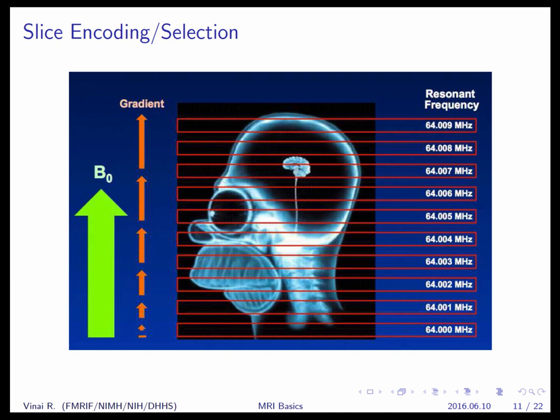So the question, I'm just going to say this for the recording, was how can we tell between the different tissues, or how to localize within the tissue? The answer to that is the differences that the hydrogen atoms experience because of the variation in tissue are actually much, much smaller than we impose with these gradients. So it's orders of magnitude difference.